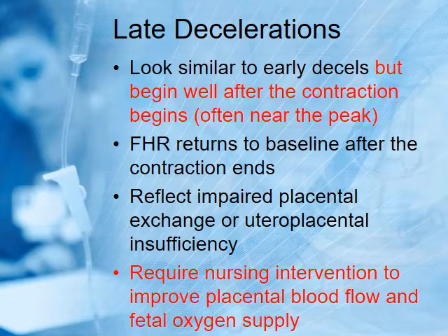Now, late decelerations, at a glance, they look similar to the earlies because they slow down and up, but they begin late, after the contraction peaks. After it begins, often near the peak, that's when they start. The heart rate will return to baseline after the contraction ends. Late decelerations are a concern.